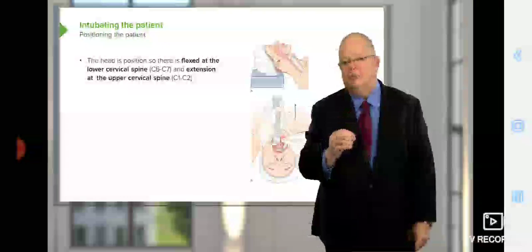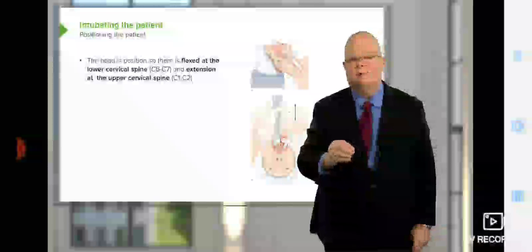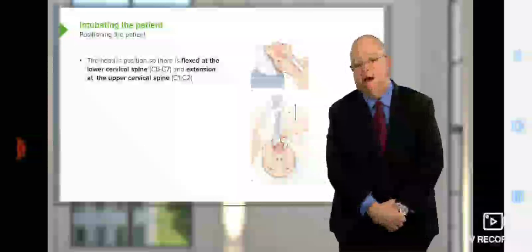You should always have something under the head. One of the fallacies of people who don't intubate frequently is that they throw the pillow across the room to get it out of the room, and then an anesthesiologist has to come in and put it back and intubate the patient.